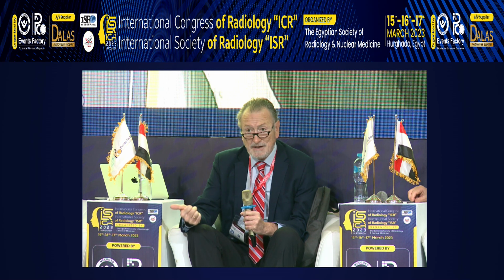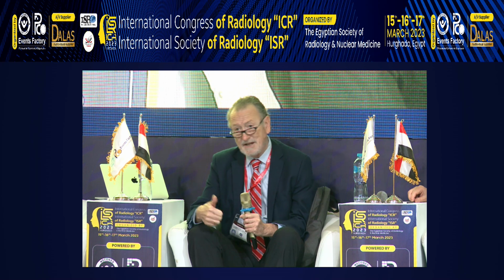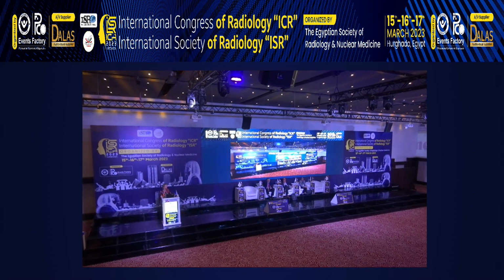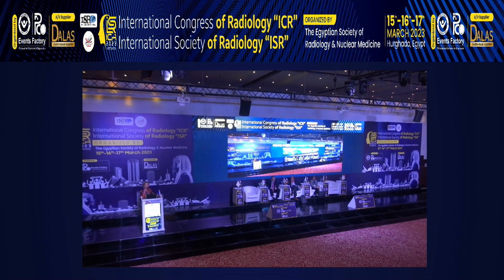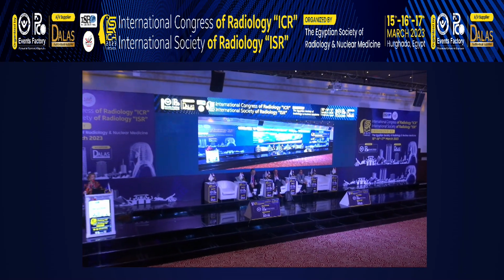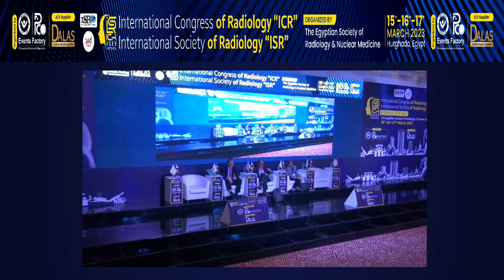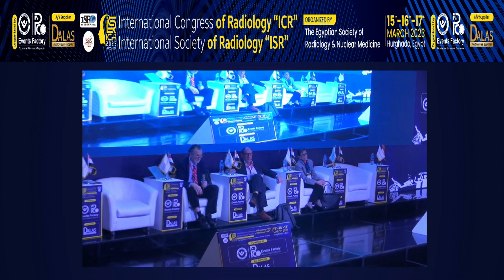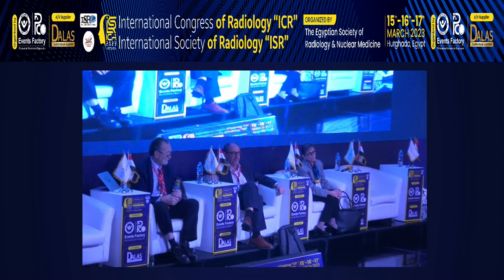That is very typical with the spondylodiscitis. The patient cannot move himself, it's very difficult, and on the laboratory data, C-reactive protein. But it's a very tricky situation. Not always possible to make the differential diagnosis. Thanks. Thank you. Thank you.